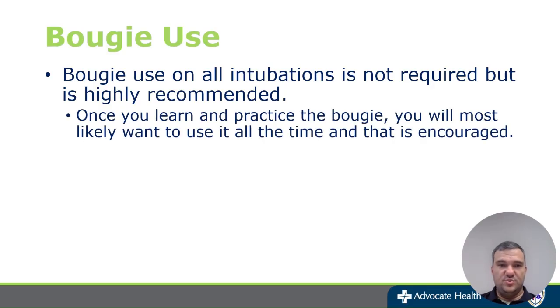So as far as using the bougie, it's not required. If you're comfortable using the ET tube and stylet that you are right now, you don't need to use the bougie. We're not mandating it. We're not making it something that needs to be used on every intubation attempt. I think after a lot of you practice with it and use it, you are going to want to, because it does make things a little bit easier, because the tip of the bougie is much easier to pass through the vocal cords, especially in the more complex airways. So I think it's going to be an excellent tool added to the tool bag, but you don't have to. It's whatever you're most comfortable with as you're doing things, but I do encourage that you at least try and practice with it.